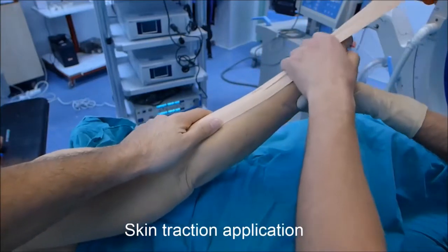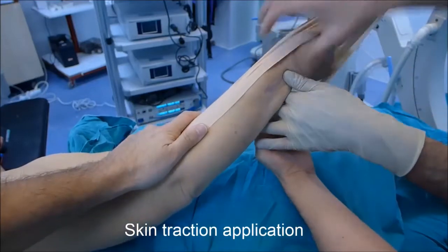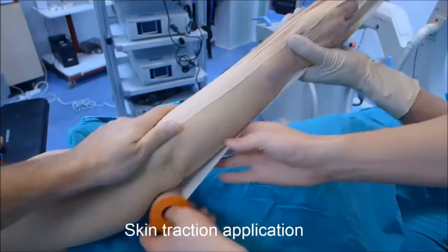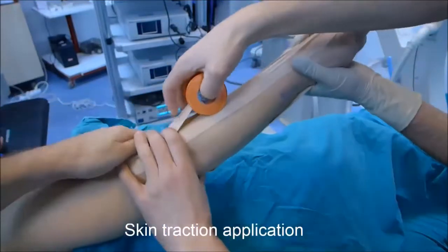After routine lateral decubitus positioning of the patient, apply skin traction to the forearm with ordinary sticking plaster tape. Apply the tape in a sugar-tong fashion to the radial and ulnar sides of the forearm. Repeat the taping to make a two-layer strap.